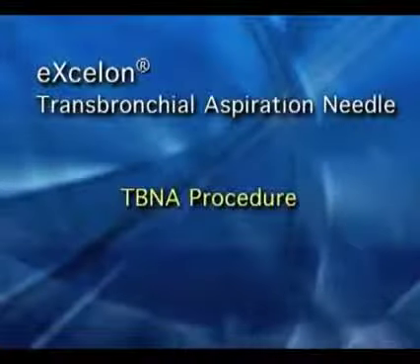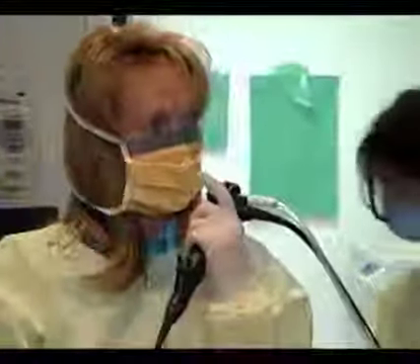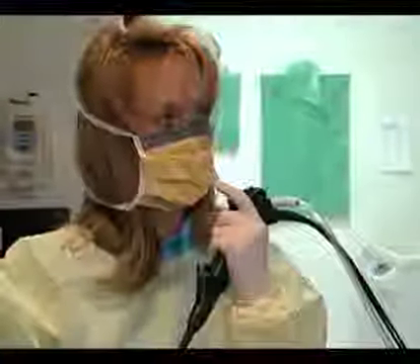I've opted to choose transcarinal needle aspiration, and also probably transbronchial needle aspiration using the left main stem bronchus to access that deep subcarinal adenopathy with a 19-gauge eXcelon catheter. The pathology that we'll be attempting to transbronchial needle aspirate to is the lower aspect of the subcarinal lymph node that was visible on CAT scan.